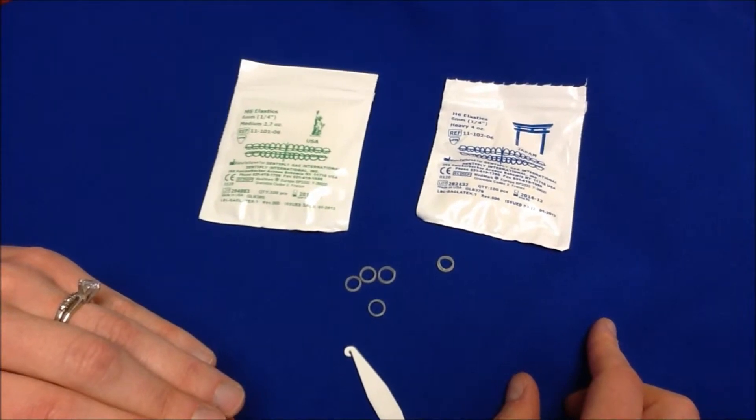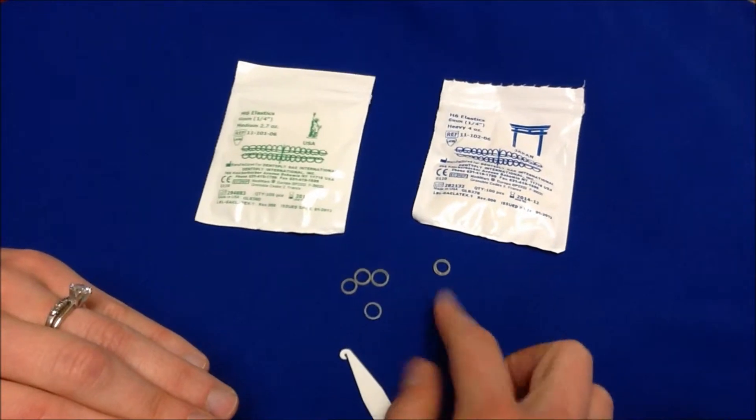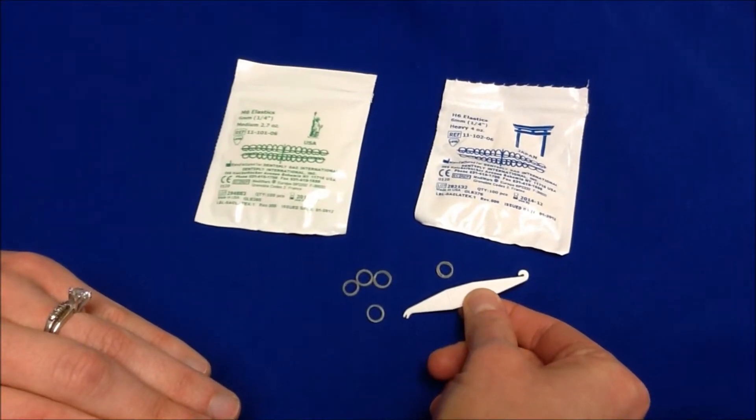Rubber bands are a very important part of treatment. In your rubber band bag, you'll find both rubber bands and a clip that helps to put the rubber bands on.